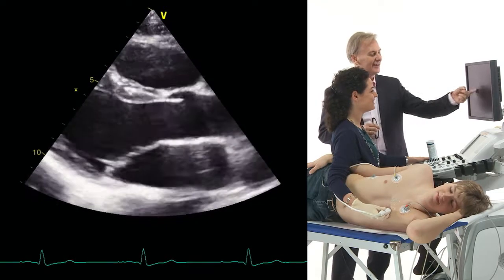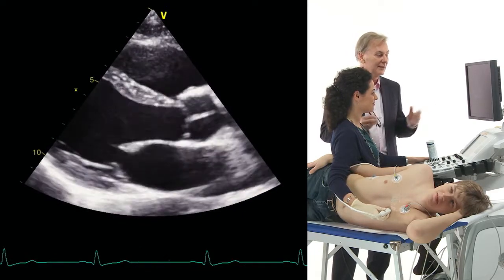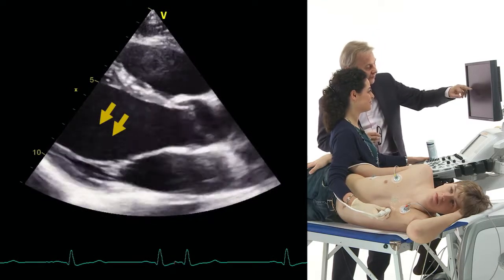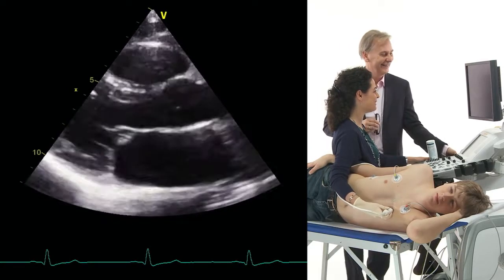But you can see that the leaflets are not thickened. You can see that the opening and closing motion is completely normal. And I'll ask you, Anna, what is this here, though? Do you see these cord-like structures there? Yes, Thomas, don't get scared. This is nothing but normal.